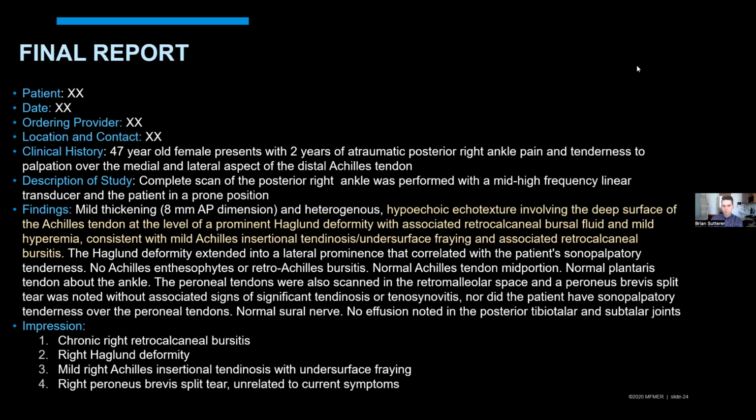So great. I would just say one other quick pearl that I think has been mentioned at this conference, but is important when you're looking at the Achilles. A lot of times we put the Achilles in dorsiflexion to try to make the fibers taut and get better imaging of the tendon, but just be aware, especially for the fellows, that that can decrease your vascularity in the tendon if you're trying to pick that up on Doppler. But great job, everybody. Thanks.